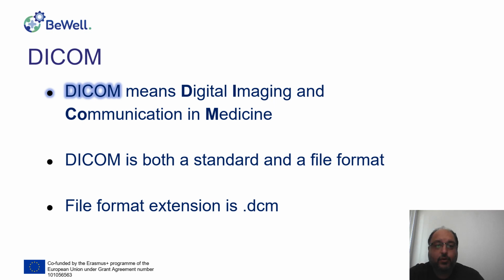DICOM stands for Digital Imaging and Communication in Medicine, and it is both a standard and a file format. The file format extension is .dcm.